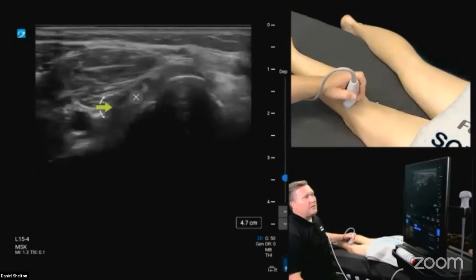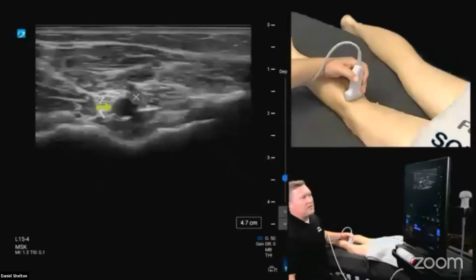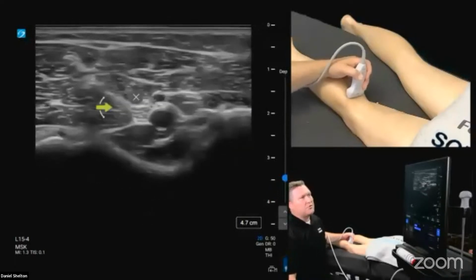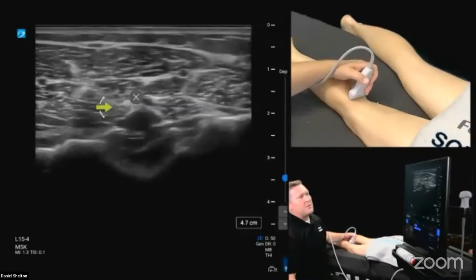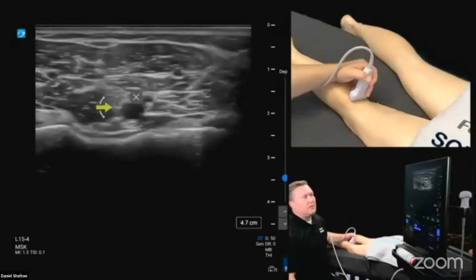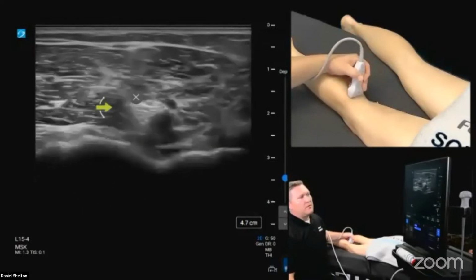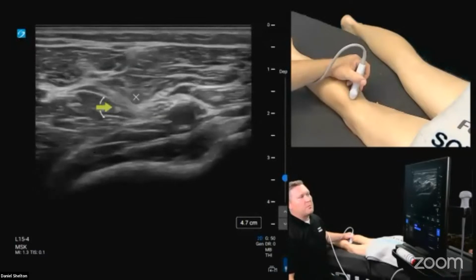But other than that, that's not a common scan, but it is fun to just challenge yourself with some anatomy in general. You look at the structures and you want to just keep in mind the angle artifact of MSK, and to always try to throw your anatomy up against the bony skeletal reference point. It's very important.